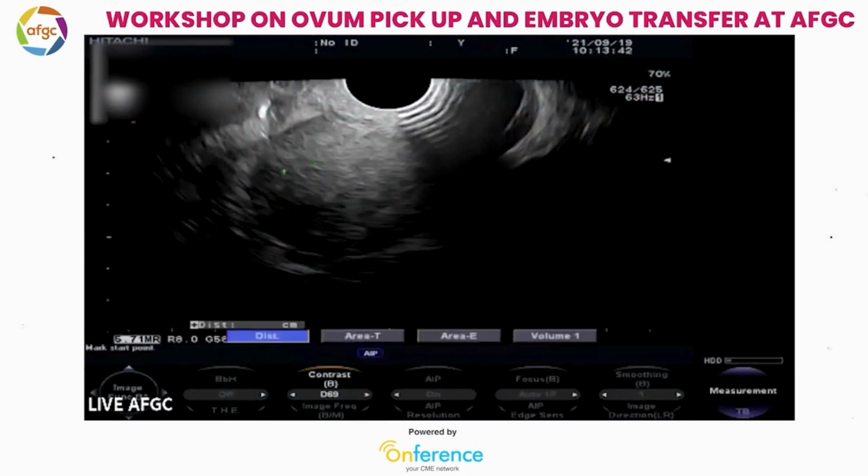So in this we are going to show you, if we can see here, it is a globular uterus. A globular uterus is usually indicative of adenomyoma. And in this you see that the myometrial thickness is more than usual. The junction between the endometrium and myometrium is not very clear. And we shall come to other points of adenomyosis soon.